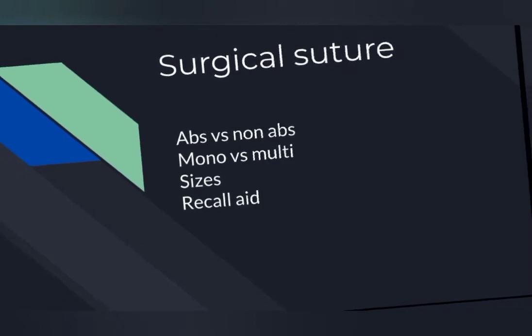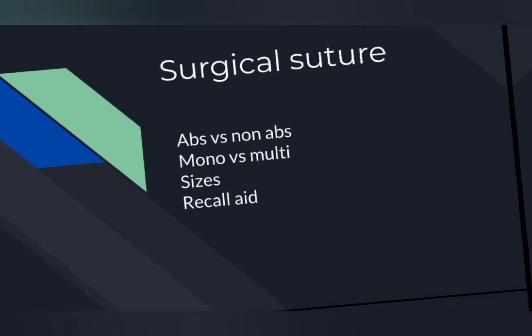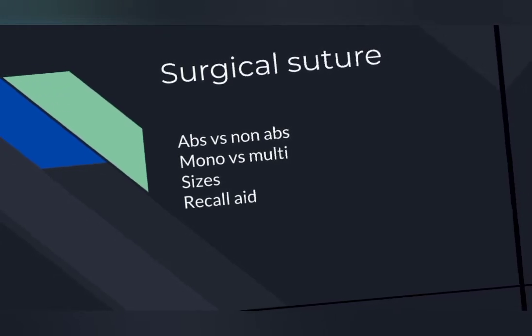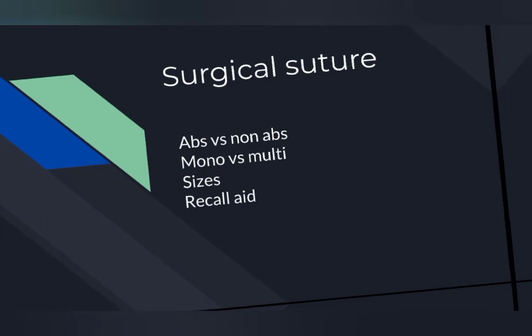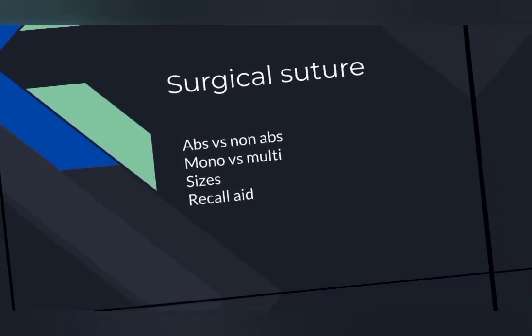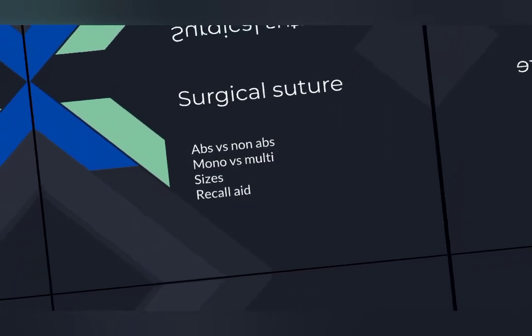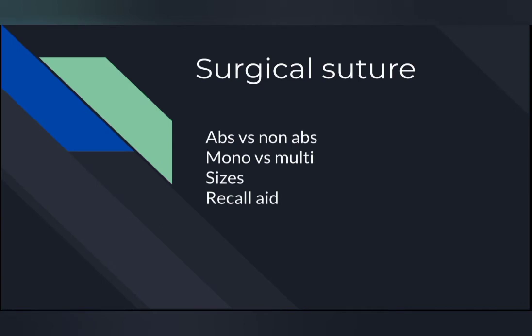So where do we exactly leave them? Probably on the inside. On the inside of the body, you don't want to be opening up incisions to remove sutures, because once you put sutures, you have to remove them if they are non-absorbable. Absorbable means they will be removed on their own by the action of enzymes.